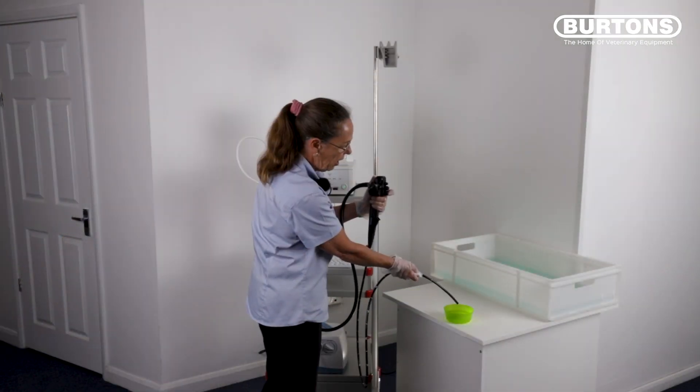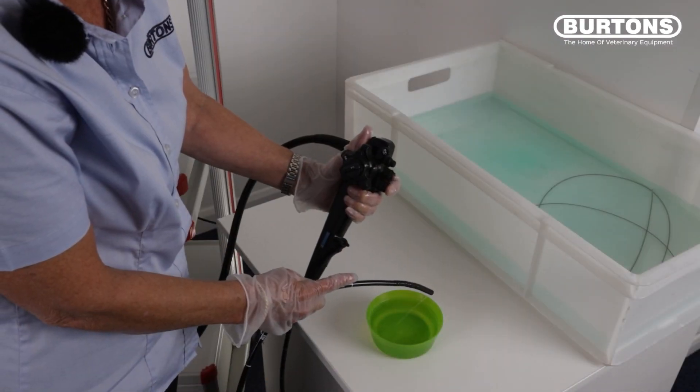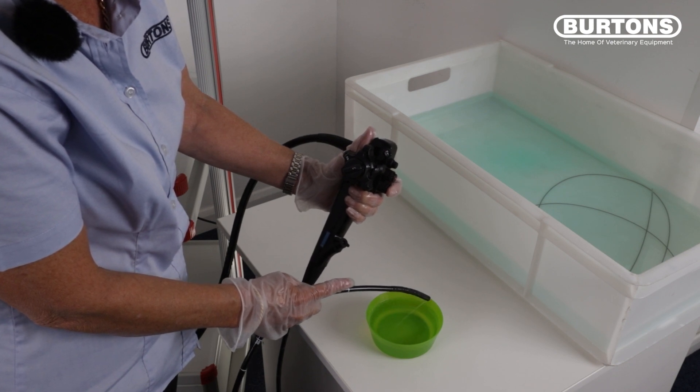Remove the tip of the scope from the water, press the blue button all the way down and ensure that you have a steady stream of water coming out of the distal end of the scope.